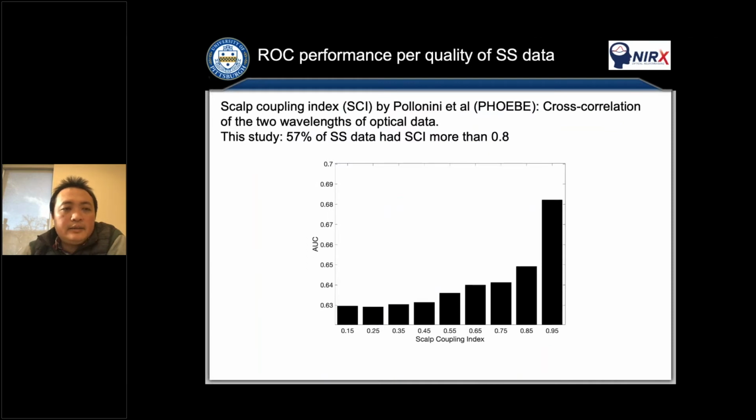And then, to look at the quality of the short separation data, we use the scalp coupling index. This is from Luca lab, from Pollonini labs, so you can look at the paper of Phoebe's papers.